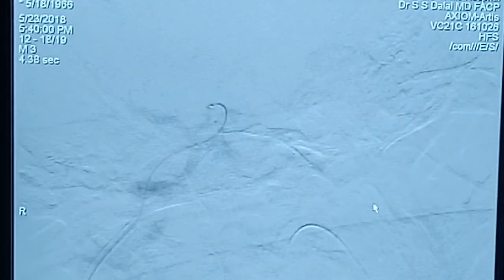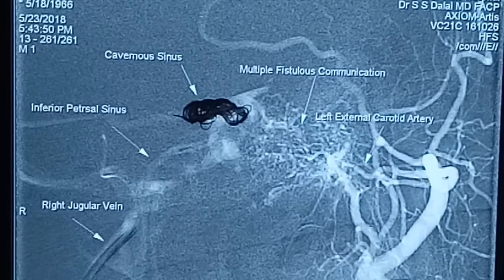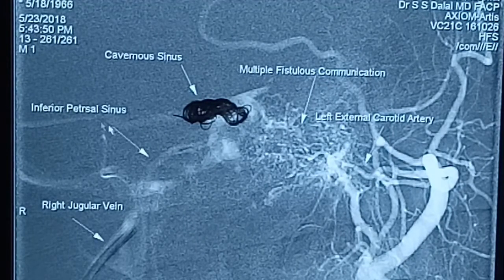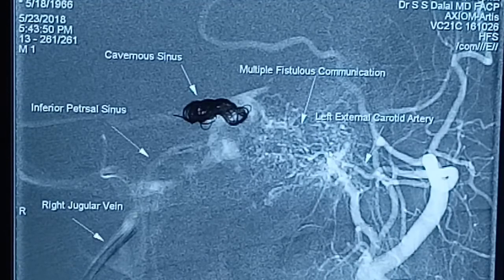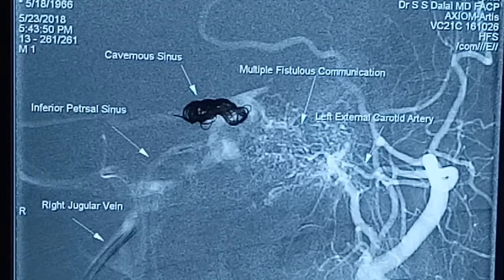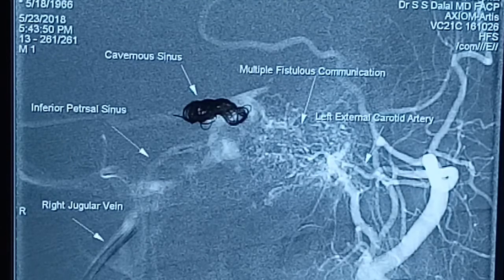This is the selective injection to confirm our position in the cavernous sinus, and we can see reflux into the superior ophthalmic vein — absolutely fantastic position. I am going to proceed with coiling of the cavernous sinus now. This is the right jugular vein, the inferior petrosal sinus, and the cavernous sinus. These are multiple fistulous communications from the meningeal branch of the left external carotid artery, and the coiling is going perfectly fine.